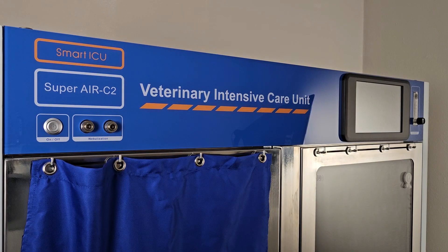Once you are ready to begin using your ICU unit, press the power button next to the nebulizer ports. You will see the screen and the front of the unit turn on and activate.